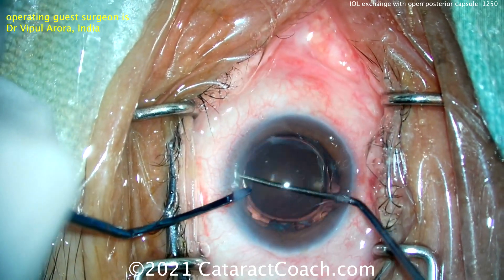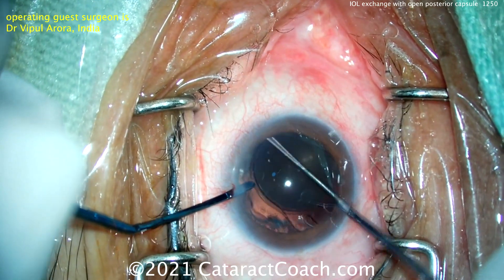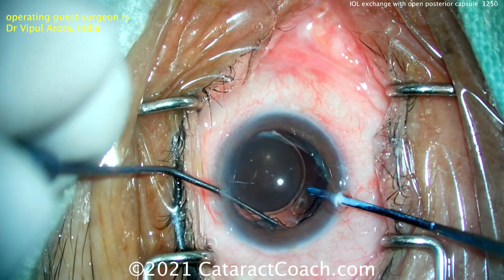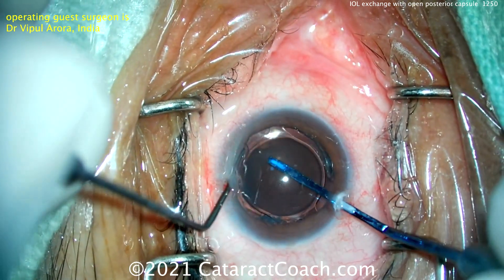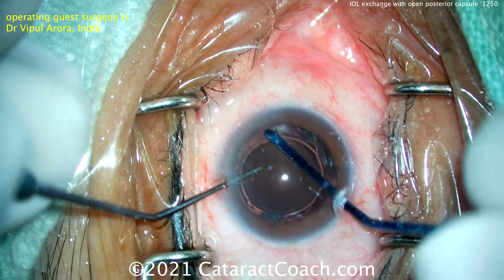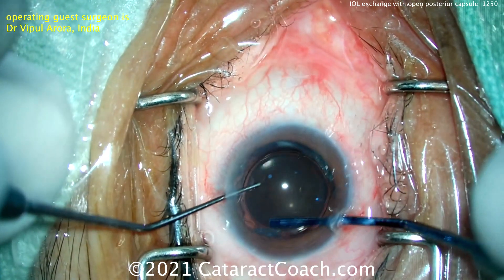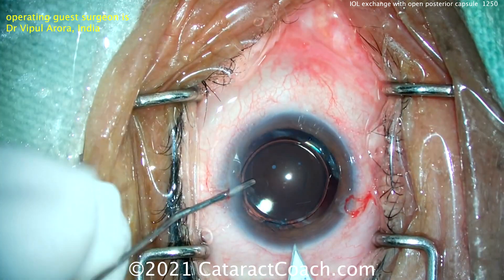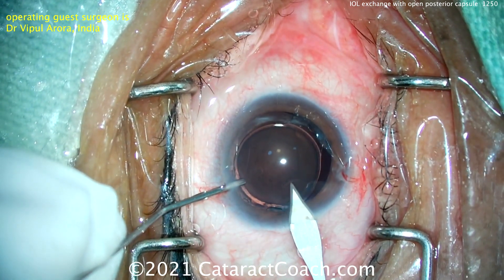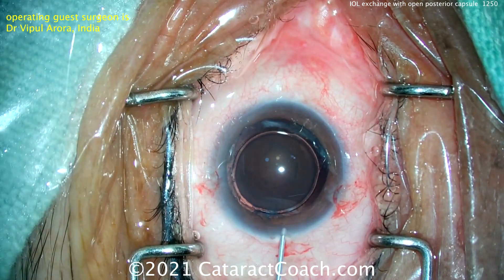Two-handed technique here, going around, trying to free up that lens, see if it will rotate at all. Once you get it freed up and it's rotating a little, that's good — you want to bring that lens up. This lens has been fibrosed in a bit. There are pockets created when the anterior and posterior capsules fuse together. So if you dial this lens, you're going to get it out of those pockets. Now making the main lens exchange incision, slightly sawing it open to get the appropriate size.